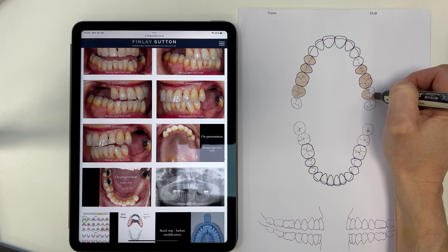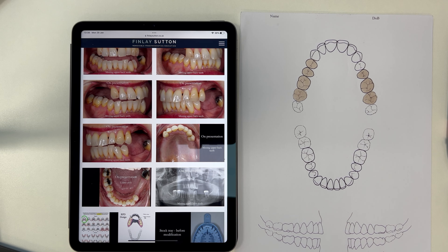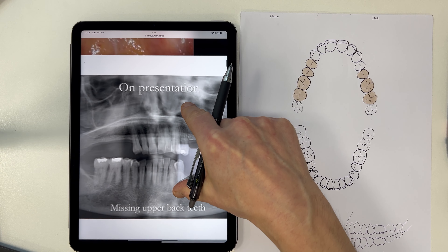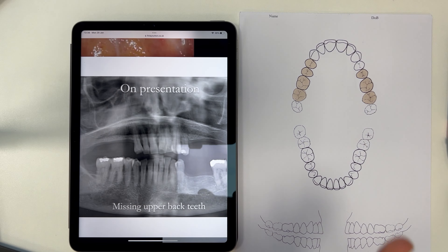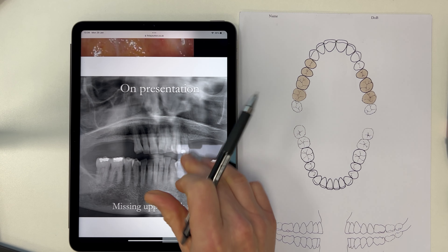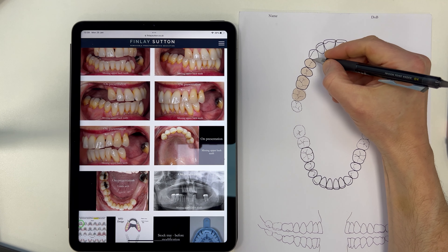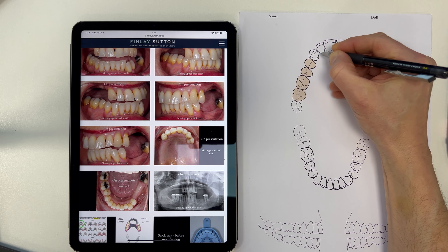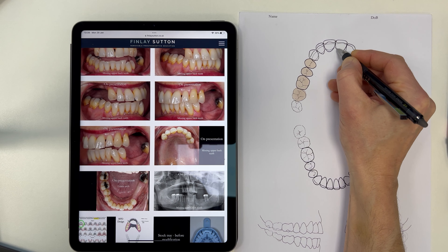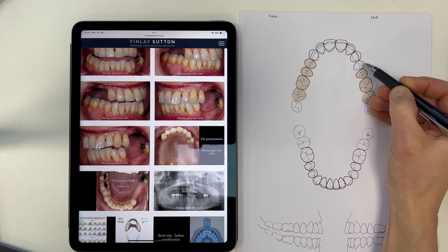Next, I'm going to start thinking about support for the denture itself. What I was a little bit concerned about is she's already shown that she can potentially lose teeth further back here, so I'm going to go along with putting backings on all of these teeth here. Should these upper anteriors fail in the future, we can add to the denture — metal backings like this, like a continuous resin bonded bridge across the back just there.